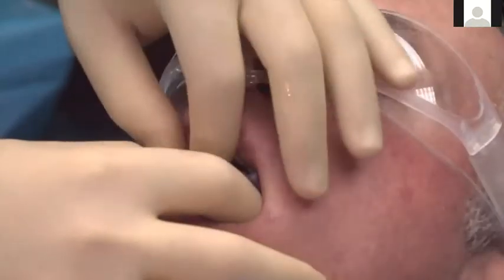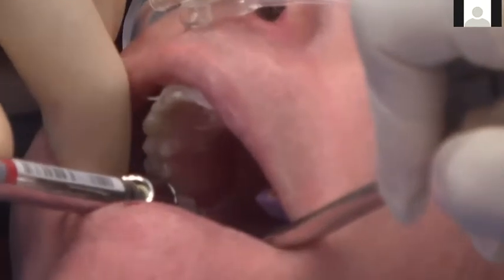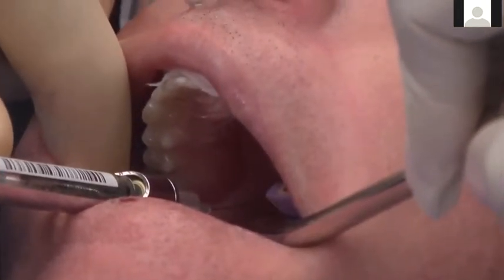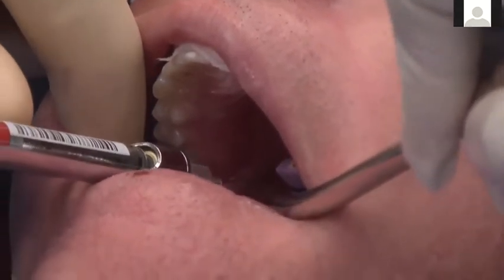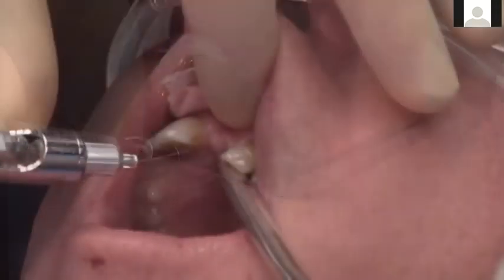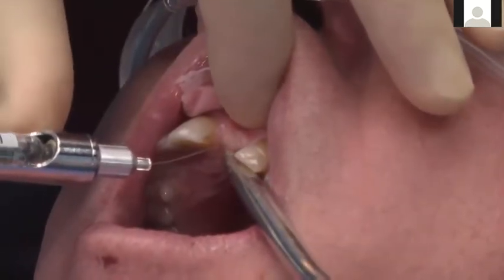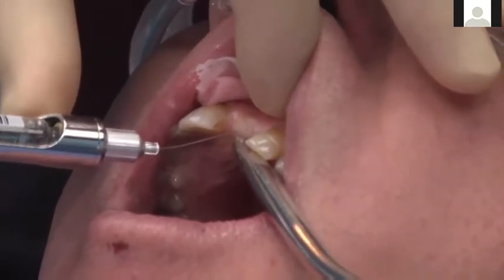Here in this case, we also, just as pointed out, wanted to do a connective tissue graft. So here I'm anesthetizing the greater palatal nerve posteriorly as well, because we're going to harvest the connective tissue graft from the palate. Now, this is not something I'll show in this video. We'll talk about how to do that harvest in some subsequent videos on other cases. This was not part of this video presentation.